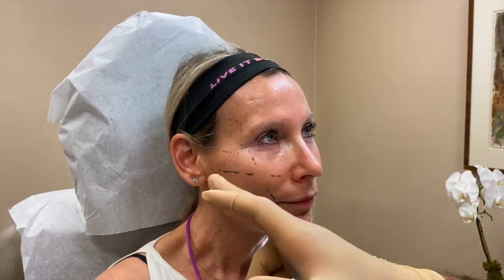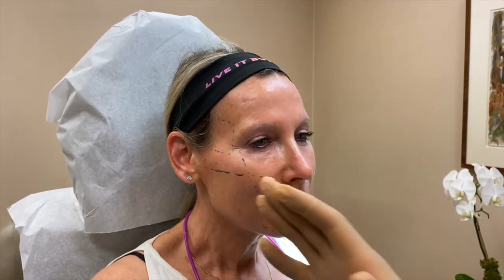Now, we haven't even addressed your chin yet, but what I want to do is really now duplicate what I did on this side here, and then we'll focus on your chin, because you'll see how your chin will even make that better and will improve your angle here. But I already love the results.